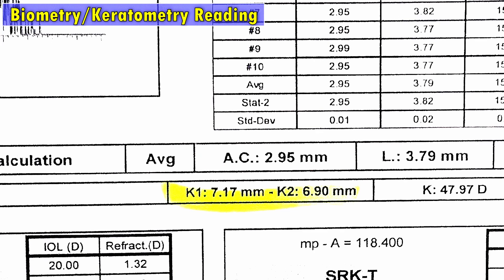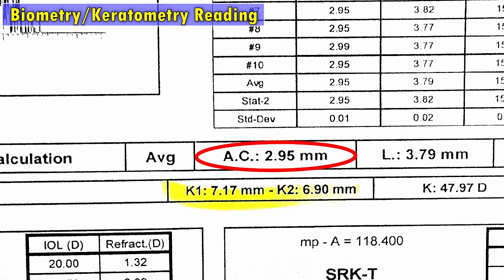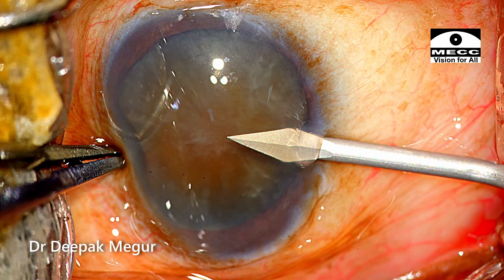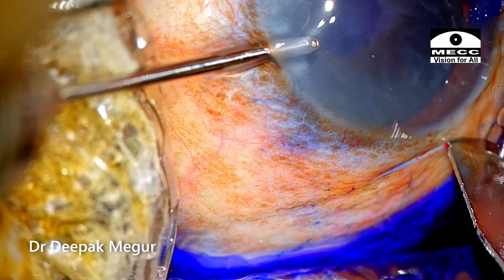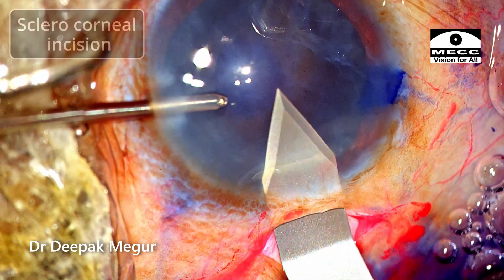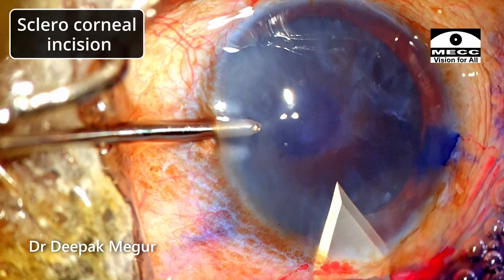The anterior chamber depth is around 3 mm — not very shallow, which is quite favorable for this patient. The anesthesia is posterior sub-Tenon's. I'm planning a scleral incision purely because if the need arises to convert to SICS, I can use the same incision. That was the reason for performing a sclerocorneal incision in this patient.